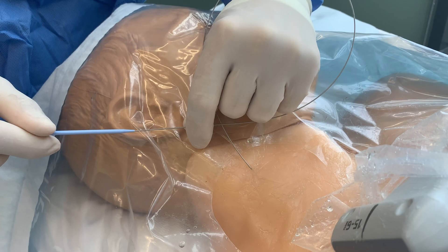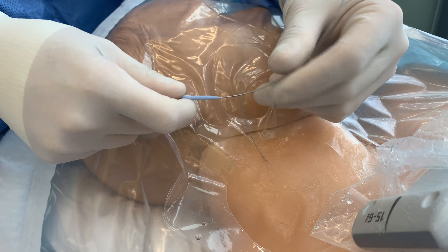Next, advance the dilator with a slight twisting motion over the guide wire and remove.